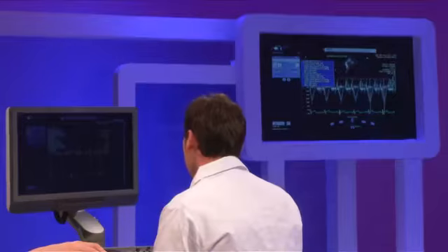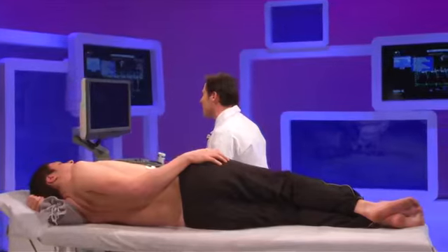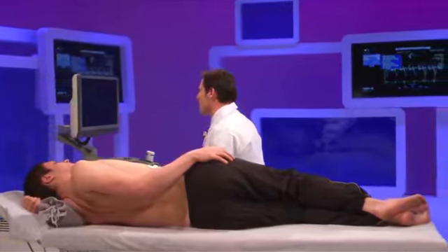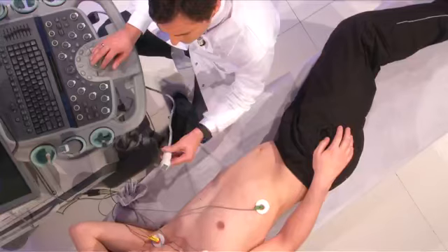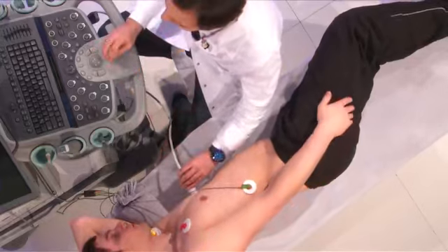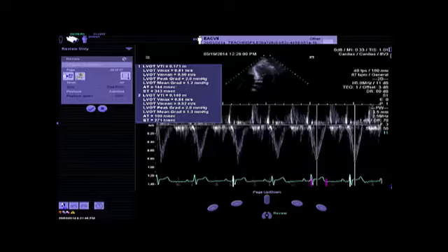So now let me finish these presentations with the important part, that is the assessment of the consequences on the left ventricle. So for doing so, I will again start by the parasternal long axis view, and I have acquired this image. Maybe I can also try to have this image in my thumbnail.